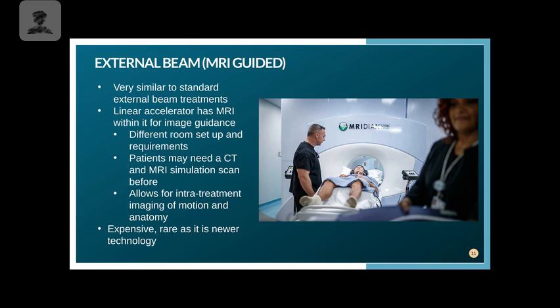So some patients, before they would receive this type of treatment with the MRI machine, they would also have to get a CT and a planning MRI. So they couldn't just get the one, they would have to get both. So that way the dosaging would work out. And that's more on the dosimetrist side. That's not really us per se. But obviously that's just extra dose for the patient and an extra scan they would have to pay for.